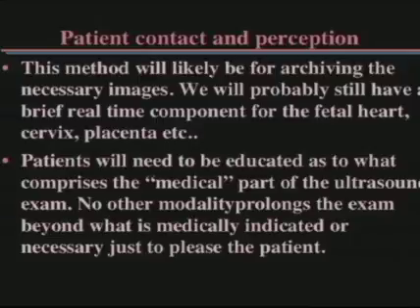As far as the patient perception, this method is probably going to be mostly used to archive the images that we need. Instead of taking them one image at a time, we can take a whole sweep, archive all of the images with one button, and probably still have plenty of time to do a brief real-time component for the patient, and also to look at the heart and the cervix and the placenta. Of course, the patient will need to be educated as to what comprises the medical part of the ultrasound.